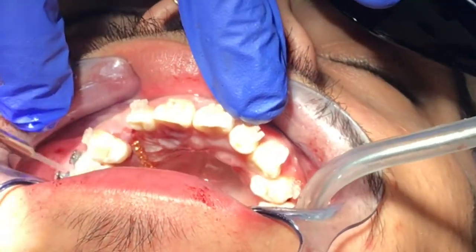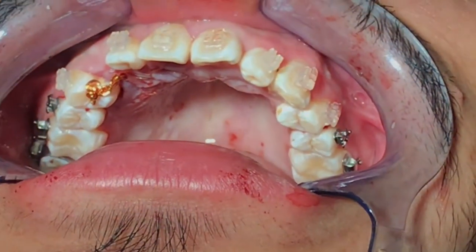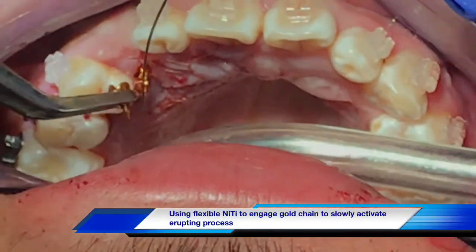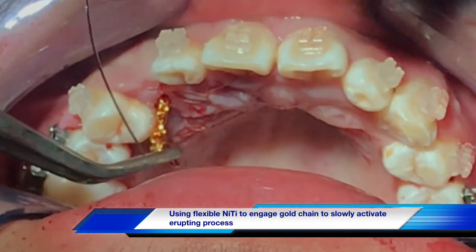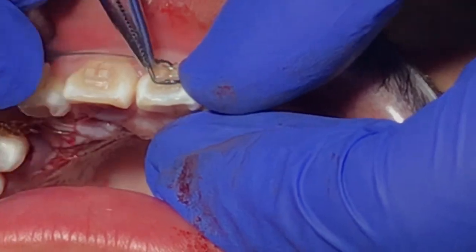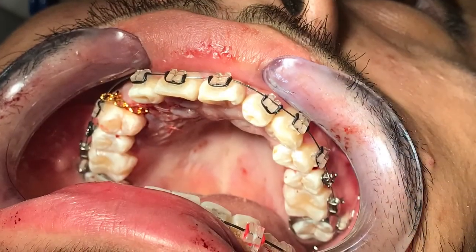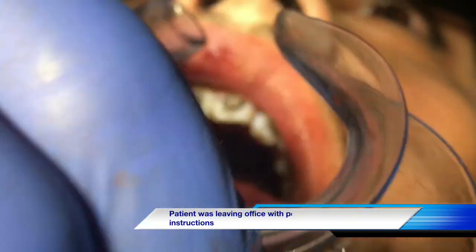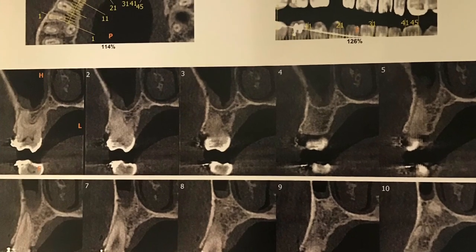Once the session is complete, we can evaluate the area before we attach the gold chain into the NiTi wire to continue orthodontic work. We will revisit the patient after one week, two weeks, and one month, following up to make sure that the canine is activated and slowly erupting.